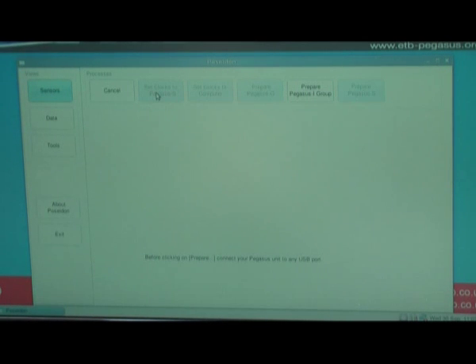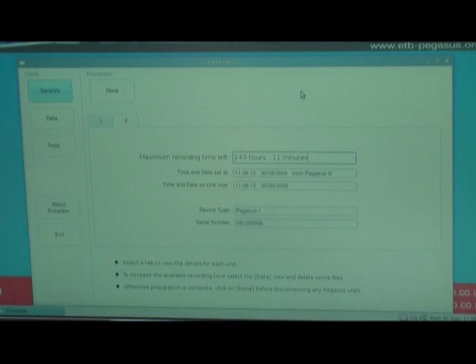As you can see, quite quickly a bar appeared and disappeared because it had the GPS location quite quickly. What I now do is go to Prepare Pegasus I Group. This means that the GPS time will be stamped onto the four individual limb sensors.